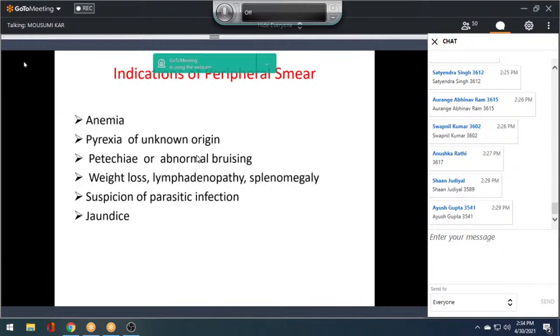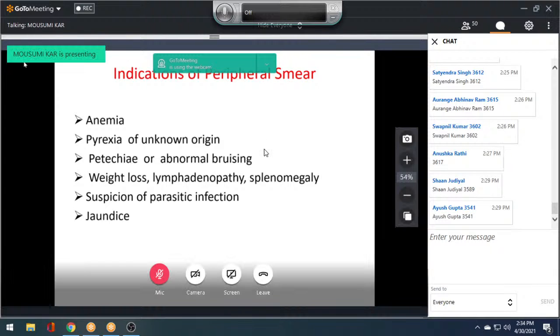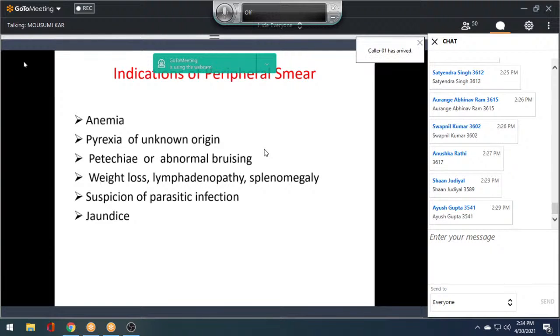You can also use it to study platelet count and morphology in cases of bleeding disorders. And you can rely on peripheral smear obviously to see atypical cells, that is lymphoma, leukemia infiltrates. That is when a patient has loss of weight, loss of appetite, lymphadenopathy, hepatosplenomegaly, and all. So peripheral smear is basically a window to see how your bone marrow is performing. And it's a very simple, non-invasive test. You only need one drop of blood, very simple staining, very simple preparation. And so that is the first test that you do with CBC along with a peripheral smear.